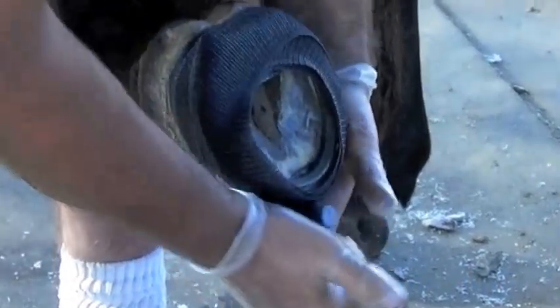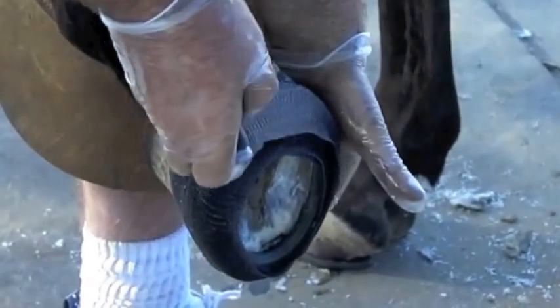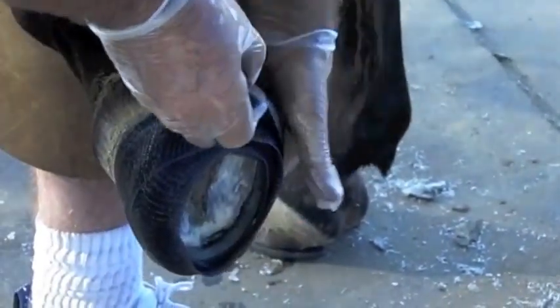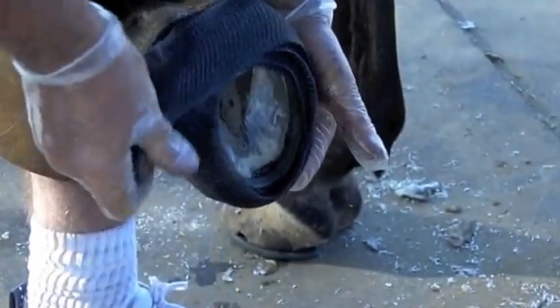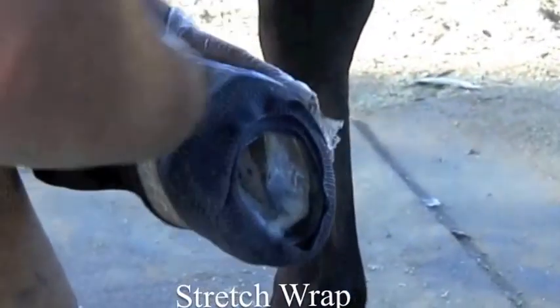It's also important to make sure that you're covering the toe of the shoe as well, because that's what's going to wear. You want to make sure you've got plenty of casting material going at the toe and along the quarters — not pinching the bulbs, but going high on one side and low on the other. It's very important.